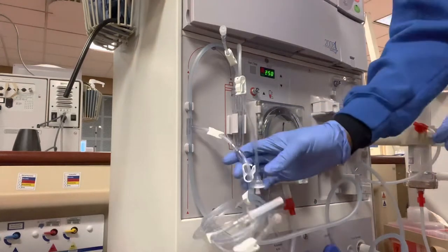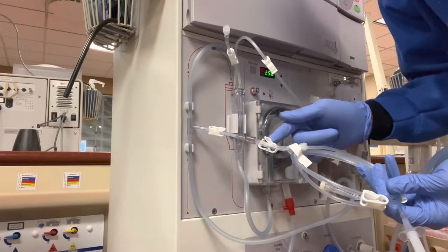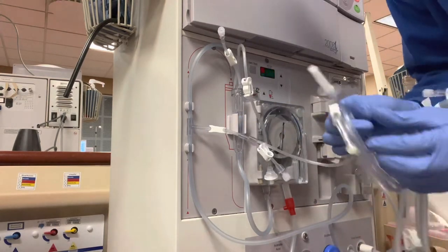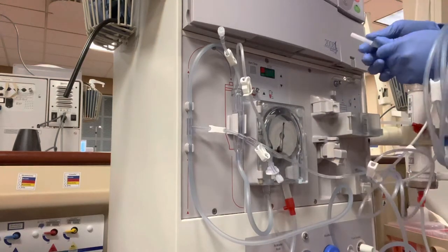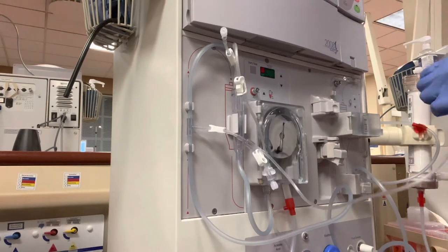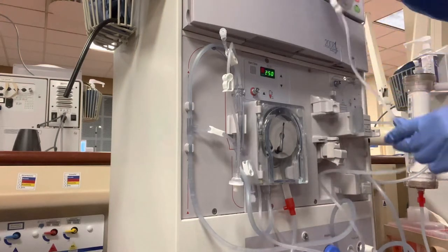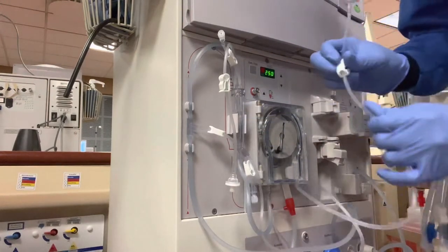Don't clamp the arch here. I clamp the tail of the saline line. I leave the main saline line open. Then I spike my saline bag. And I continue to leave the main saline line open. I do this for priming purposes, to help prime the arterial line. See?